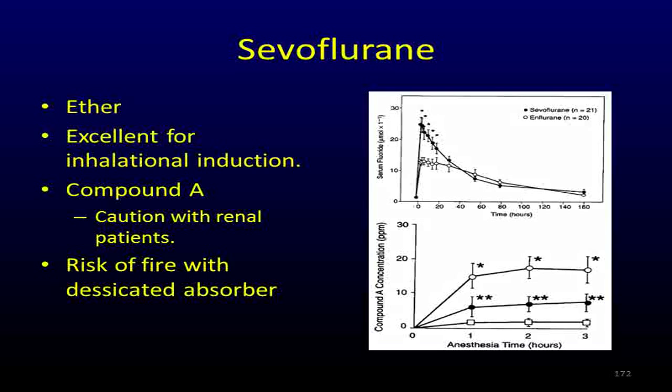So that same soda lime, right? Those granules that scrub the CO2 from the circuit. Well, when sevoflurane interacts with that soda lime, a compound is developed. Three of them, right? A, B, C, and I think a couple others. But compound A is problematic because it will kill the kidneys.